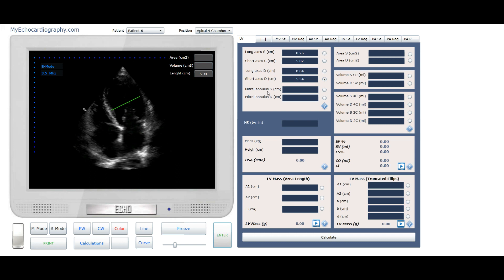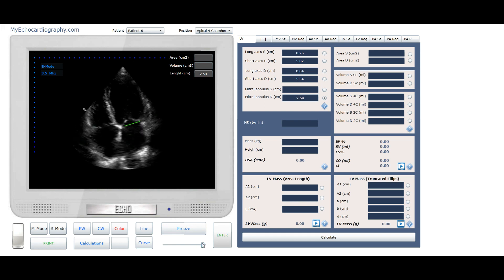Now we will assess the systolic and diastolic size of the mitral annulus. Measurement should be performed from the attachment point of the anterior leaflet of the mitral valve to the attachment point of the posterior leaflet of the mitral valve. Click the button Enter to save the values.